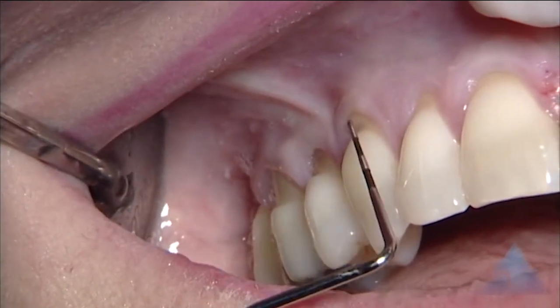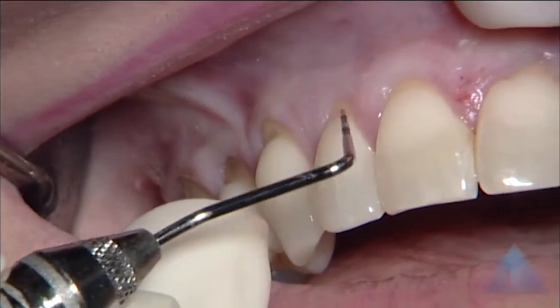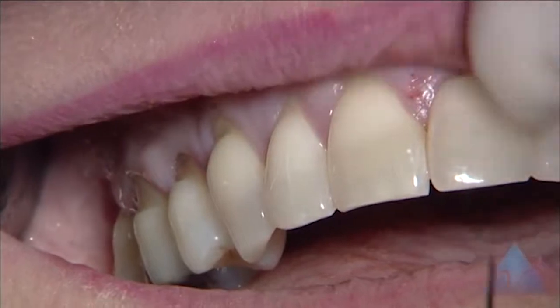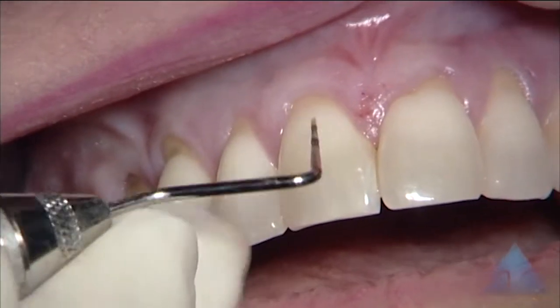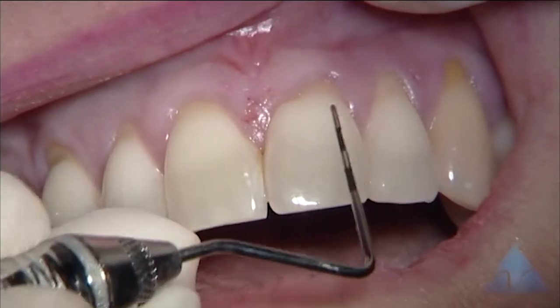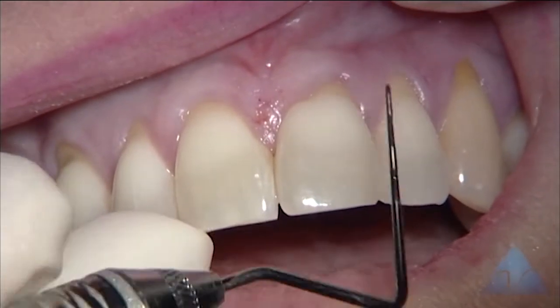We're approaching three millimeters of recession with a notch here on the canine. Close to three millimeters on the lateral with very shallow notching. Maybe a millimeter and a half on the central here, and approaching three millimeters on this distal line angle.